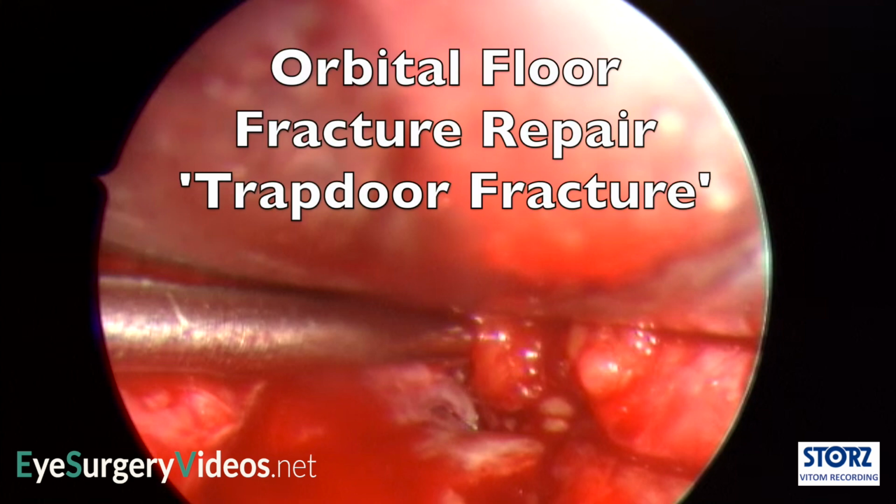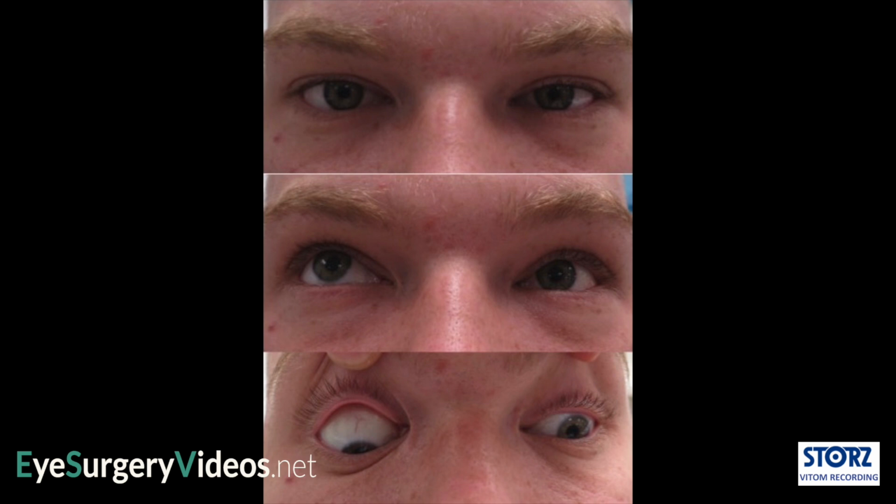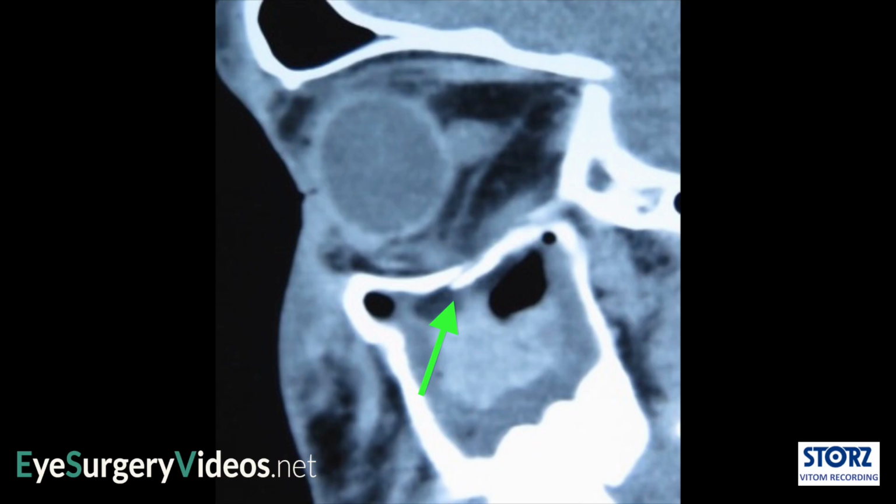This patient sustained orbital trauma 2 weeks prior to these photos being taken. The restriction of upgaze and downgaze strongly suggest inferior rectus entrapment. The CT scan confirms that a trapdoor fracture has occurred, in which a hinged fragment of the floor has been momentarily displaced to allow inferior herniation of orbital contents, and the hinged fragment returned to near normal position.